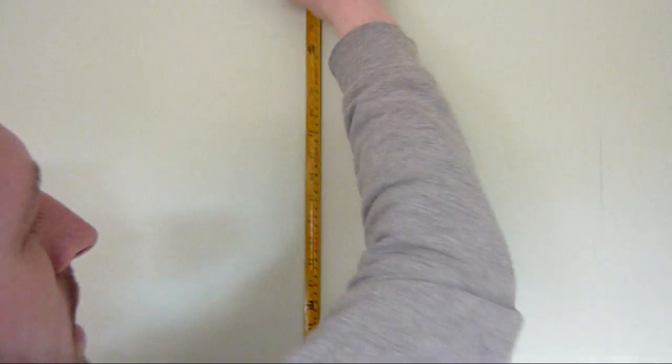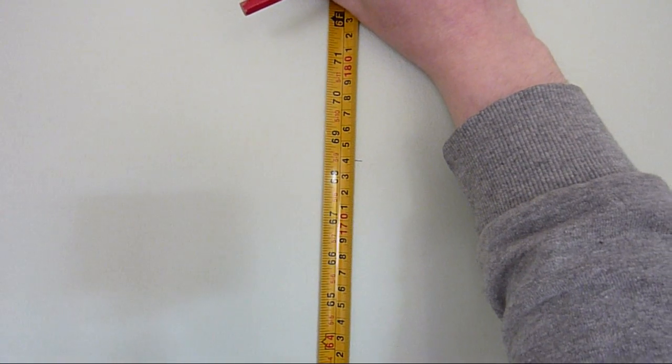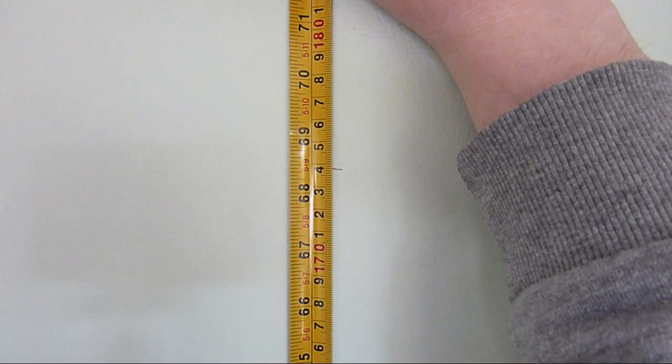Let's check that measurement out. That's right against the wall. And if you come in, we can see that it's 173 point — maybe 173.7, 173.8.